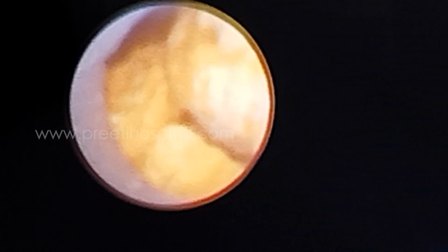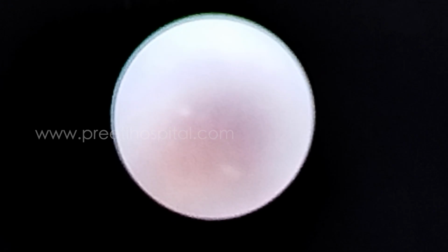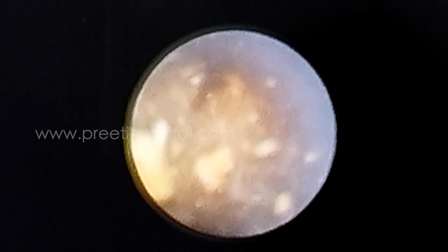From now on with pneumatic, if you want to break it, it is difficult. You got the point? So better is laser. Get the laser, thulium. Because if you make multiple pieces with the pneumatic lithotripter, it will be moving.